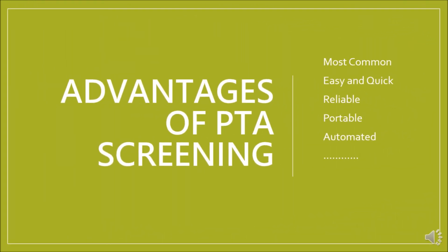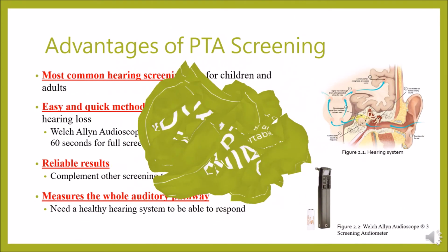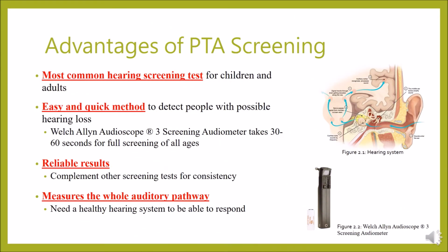Advantages of pure tone audiometry screening. Pure tone audiometry screening is the most common hearing screening test for children and adults, as most community screening programs will involve pure tone audiometry. It is also a quick and easy method.